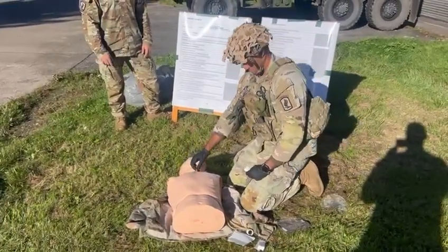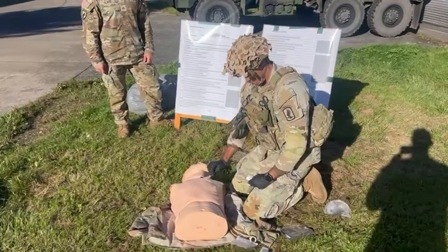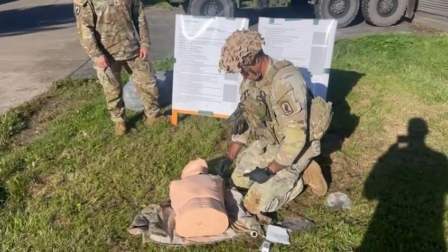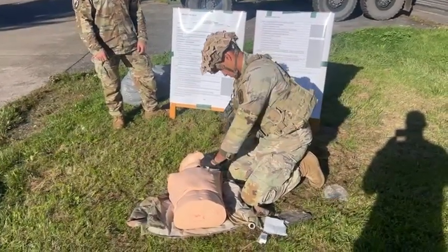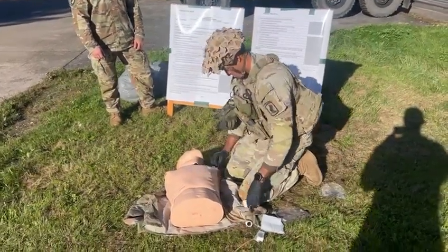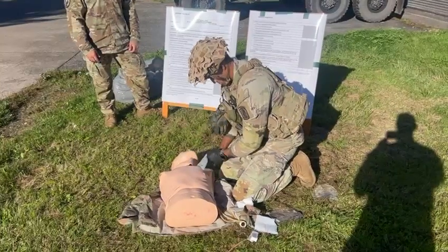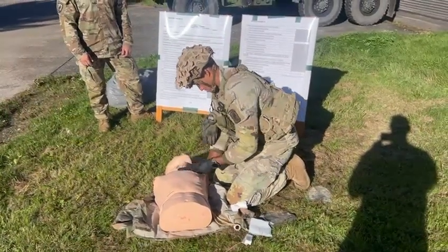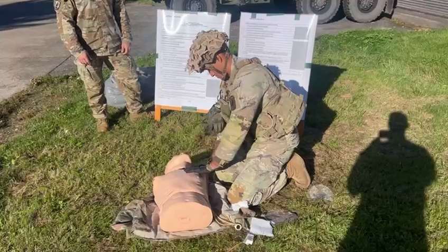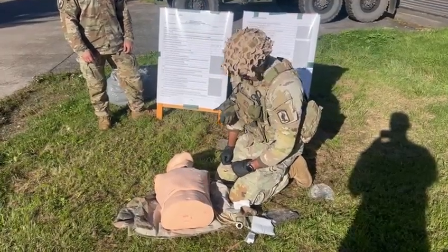Burping the chest seal. The first step of burping the chest seal is to peel the chest seal back about halfway, exposing the wound. You will then wipe the wound with gauze, freeing it of any clots or debris. After wiping the wound, the candidate will replace the chest seal upon exhalation. Exhale. You will then move directly into placing a needle chest decompression.